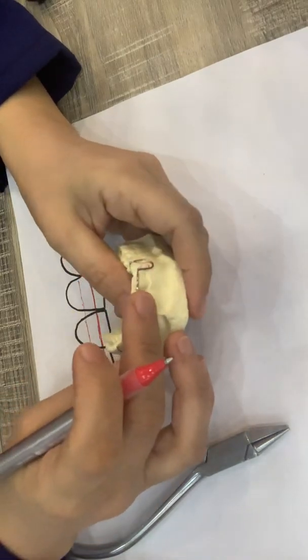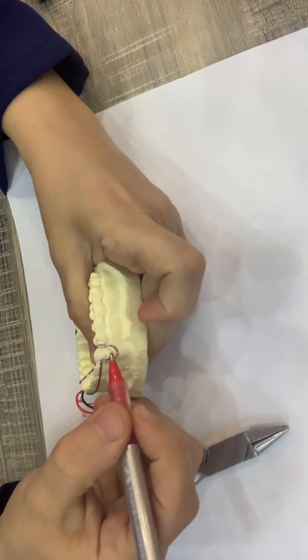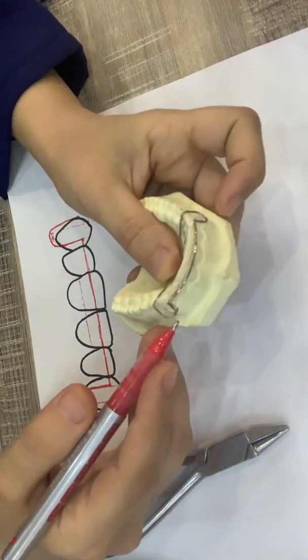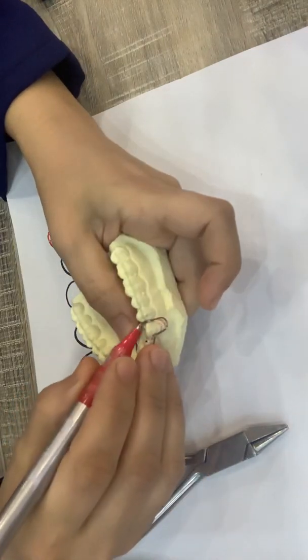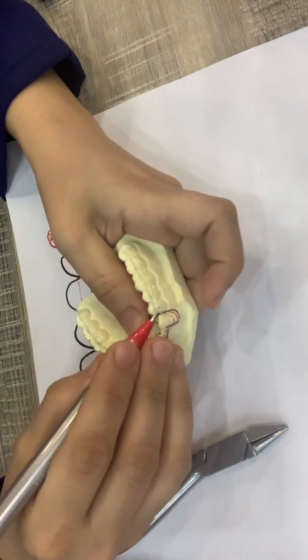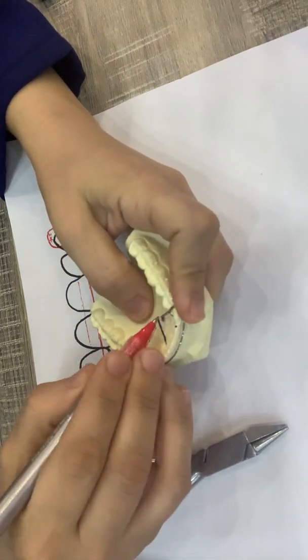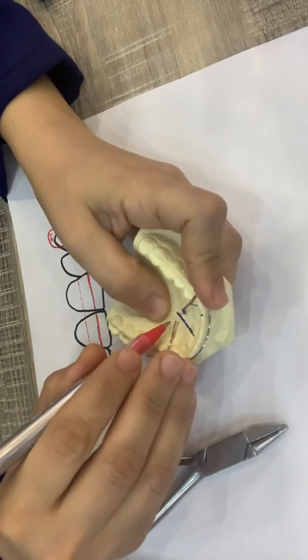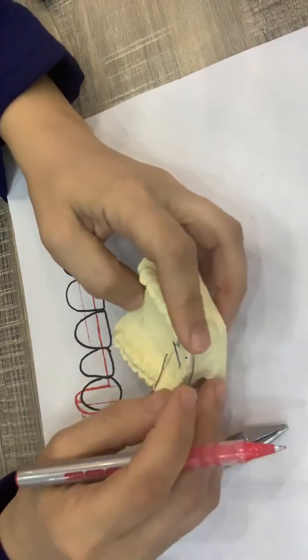Another component is the U-loop. The U-loop should be 2 mm from the gingival margin of the canine and should be away from the gingiva about 1 mm. Another component is the occlusal part, which extends between the canine and first premolar. Finally, this is the retentive tag, which ends with an L-shape bend toward the palate, about 2 mm from the mid-palatal suture.